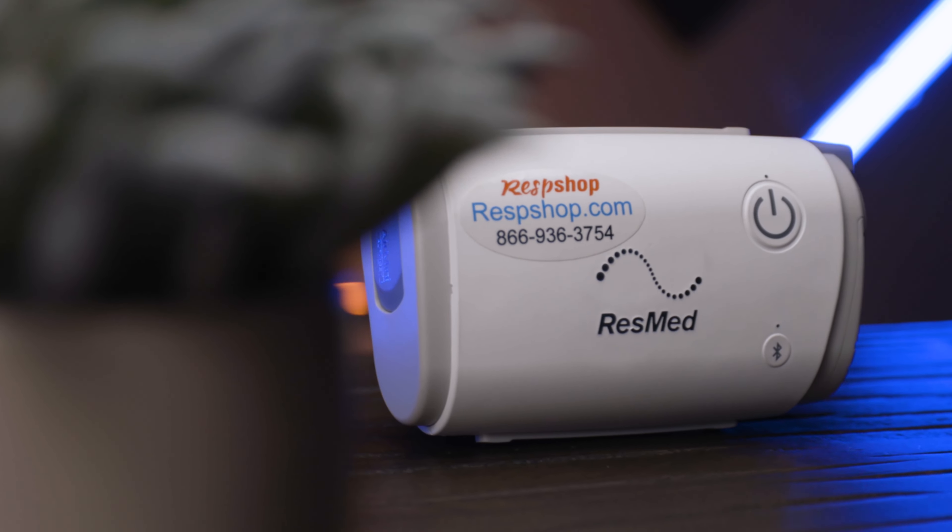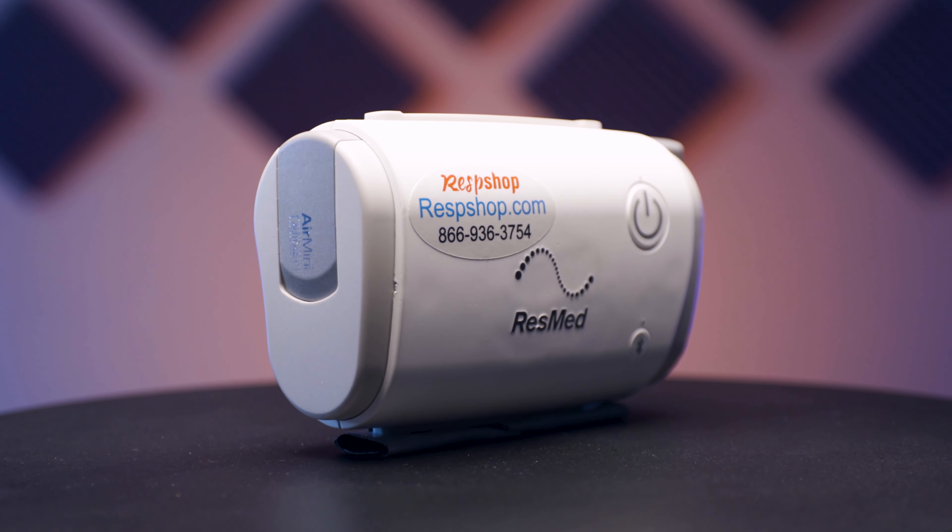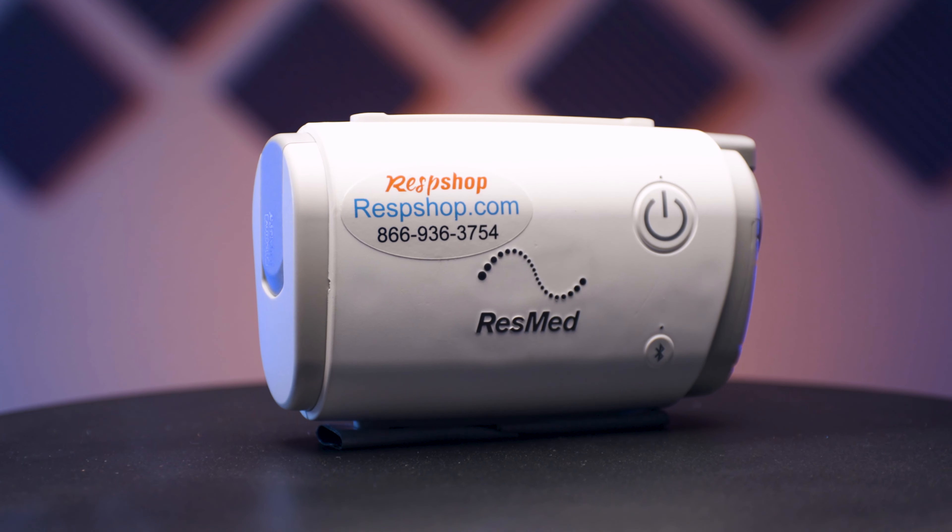I'm talking about the ways it lets you view — or really doesn't let you view — your data. This is a real downer for users who love to have full access to all the detailed sleep stats they've come to love to track and try to improve. As with many travel devices, your sleep data can't be displayed on the screen. In fact, the AirMini doesn't have a screen at all.